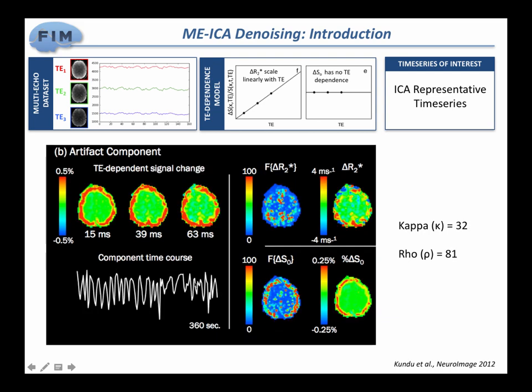If we were to take another time series that looks like most likely noise, and we do the same business, we see that it looks like this. It tends to fit only on the borders. That starts to tell me that this is a bad component, but that's not what the algorithm takes the decision on.